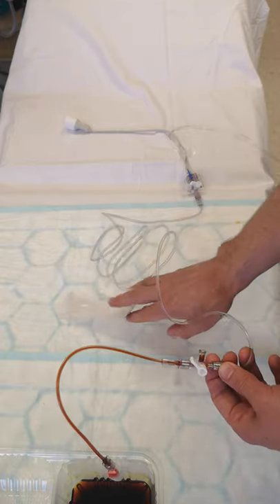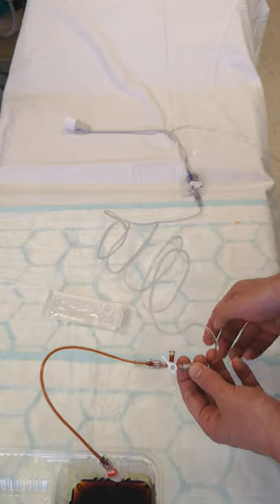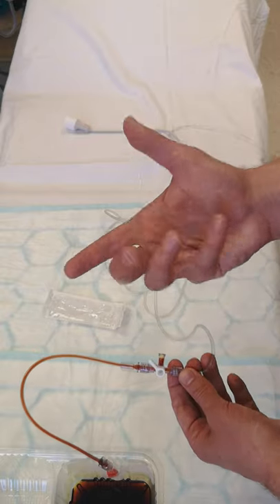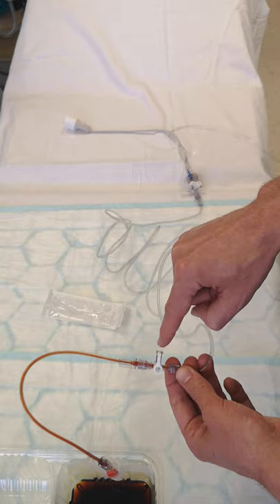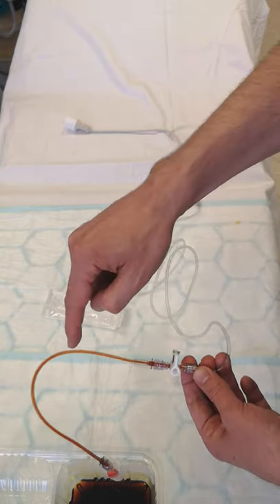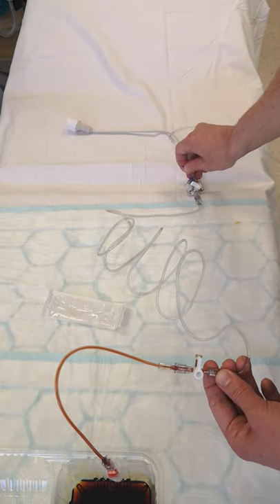You should obviously have gloves on with a real patient. Close the stopcock to the valve end, then start flushing. The blood in the tubing is sterile and fresh, so it can just go back into the patient.